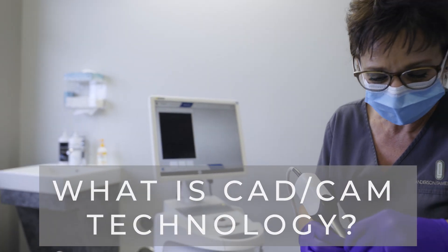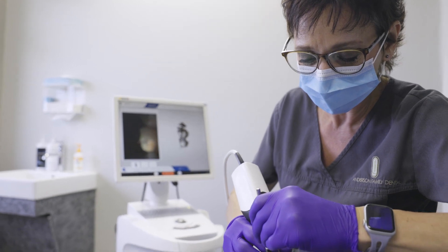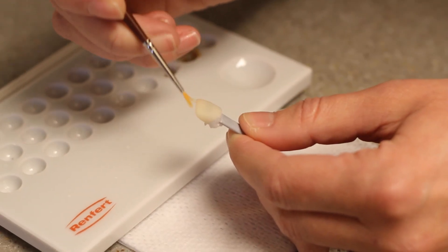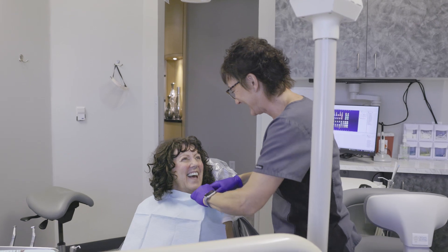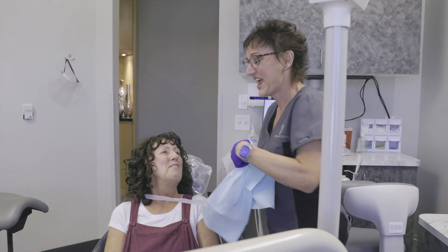One of the really cool things going on with digital dentistry is CAD/CAM dentistry. What that allows us to do is take a digital picture of your mouth instead of an impression, so you don't have to have the goop in your mouth. Then we design your crown on the computer and mill that crown. The whole process takes about 40 minutes to design and mill the crown, and you leave with the crown on — all in the same appointment.